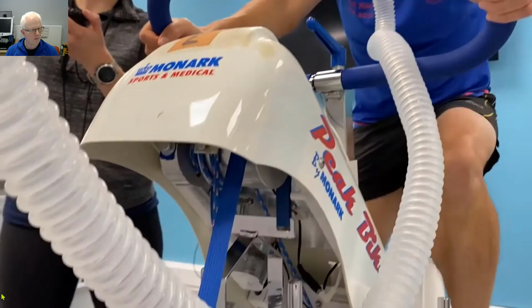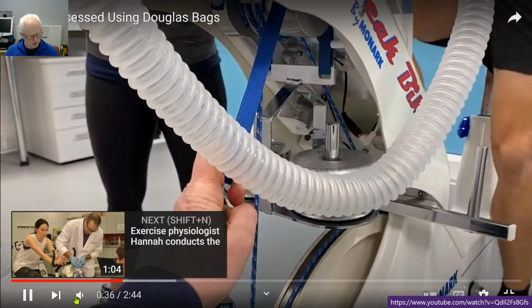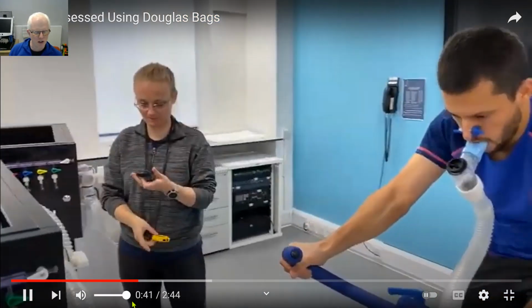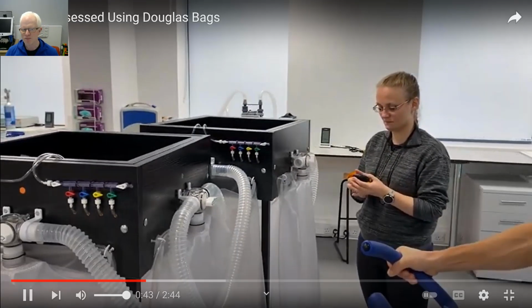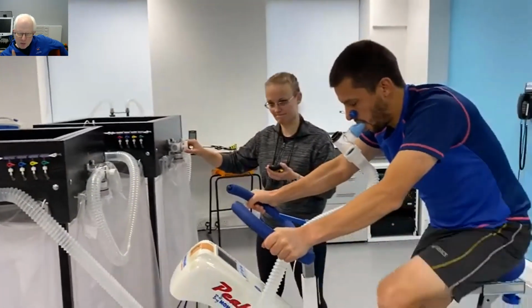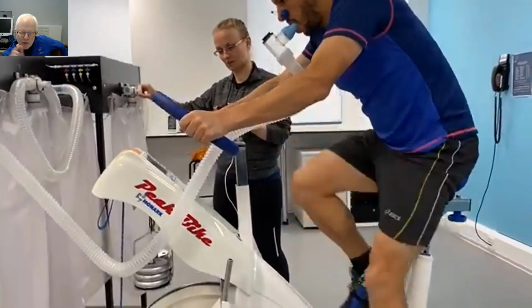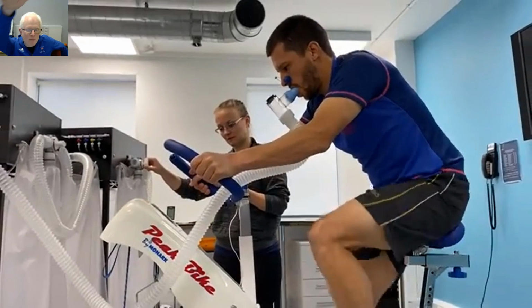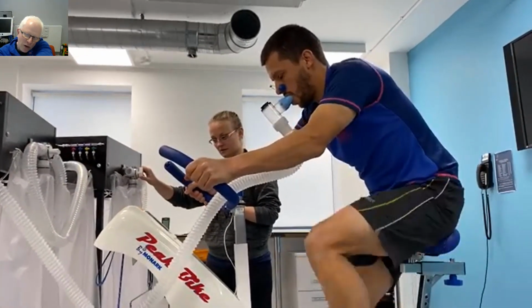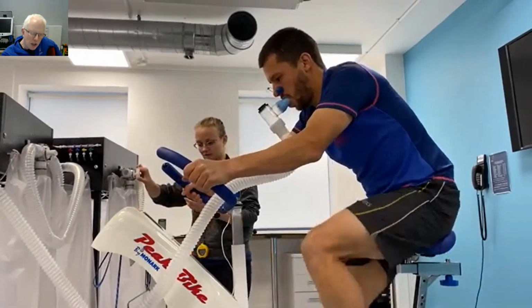So here we go. Off we go. Now the test has started. We're using Douglas bags to record the expired air. All we're doing here is taking 30-second collections into Douglas bags, and the participant is continuing breathing. What's happening now is they're building a deficit. We've asked them to work at an intensity which is way above VO2 max. They're still trying to take oxygen in. You can see George's breathing, the valve going up and down in the mouthpiece, in the filter. He's trying to take the oxygen.